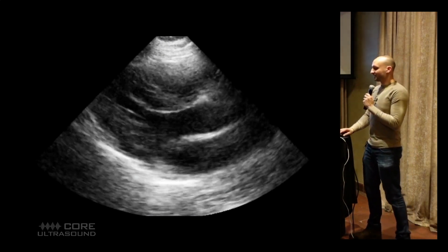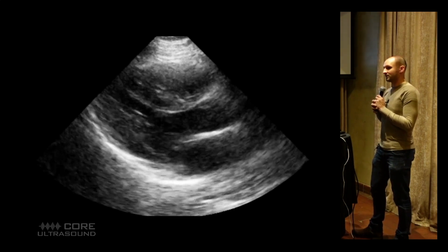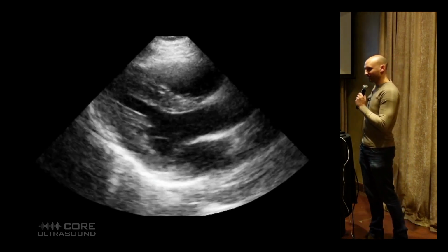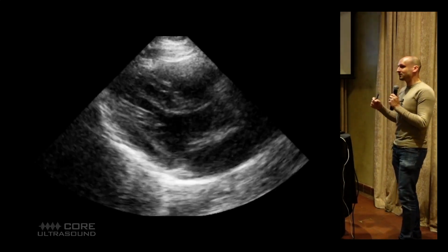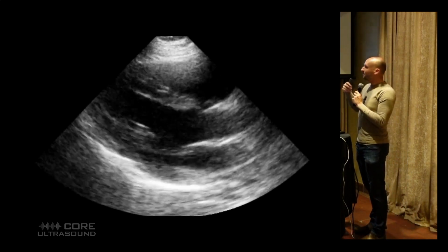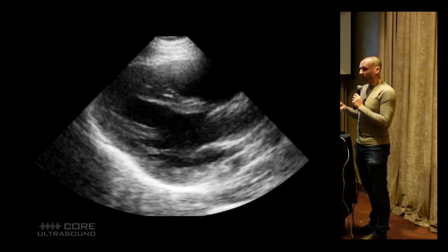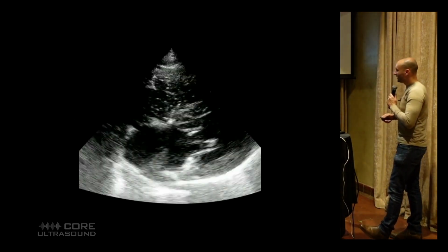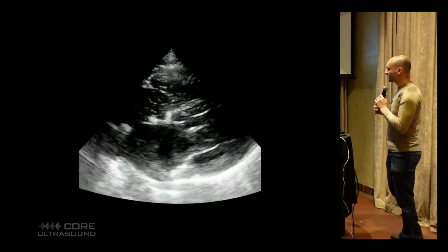Now, what if you see this and somebody says, I don't feel a pulse? What do you tell them? Shenanigans, that is correct. You call shenanigans on them and they have to leave the room, all right? So this is why this is so powerful. I am using this for the majority of my pulse checks because for me, it doesn't matter what the pulse shows. If I have a great ejection fraction, the patient has a pulse, even if they can't feel it in their fingers.